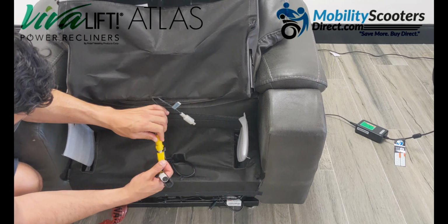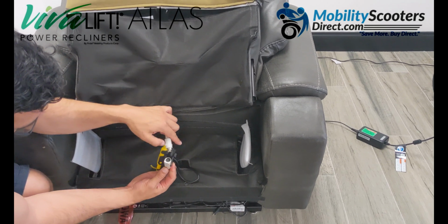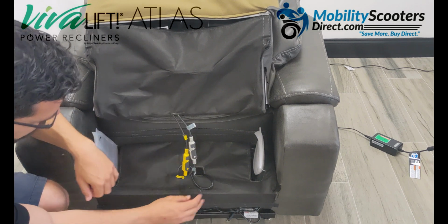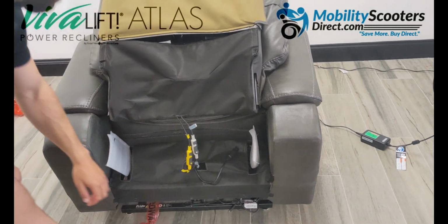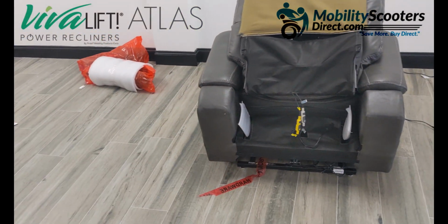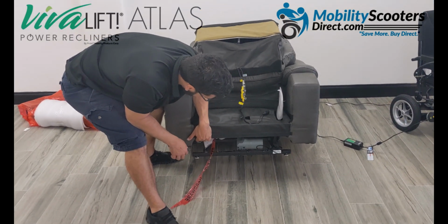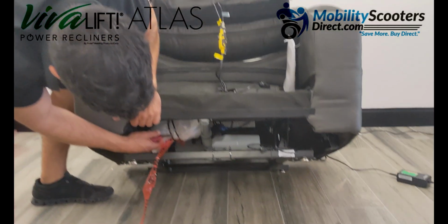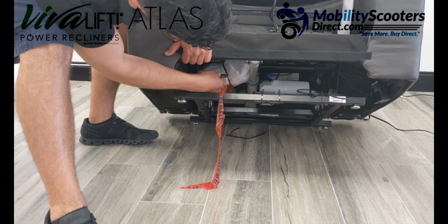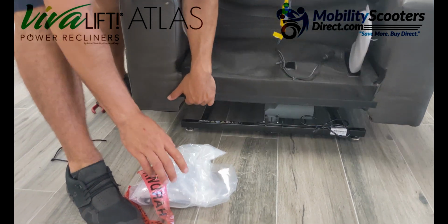You have a yellow male and female connection. The female part is connected to the base of the chair, and the male connector's connected to the top part, the back of the chair. There's one extra connector, a black one, that's for the remote control, and you'll have to take the hardware bag out. It's attached to the bottom of the chair, zip tied to the frame with 2 zip ties. You'll want to grab a pair of wire cutters or something to clip those 2 zip ties, and that's going to release the hardware bag where you're going to find the battery backup and the remote control, and we're going to show you now what that looks like.